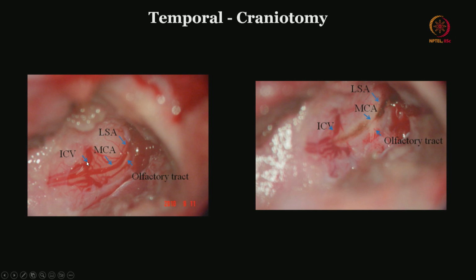In humans, it's pretty easy to differentiate between vein and artery, but in rodent, though it is a very small animal, it's difficult to differentiate by the color of it. All right. So that's the MCA vessel, and that has been coagulated using the bipolar forceps, and it turns black to brown.